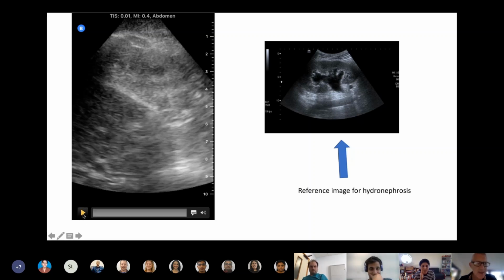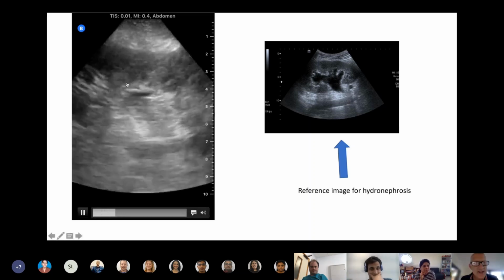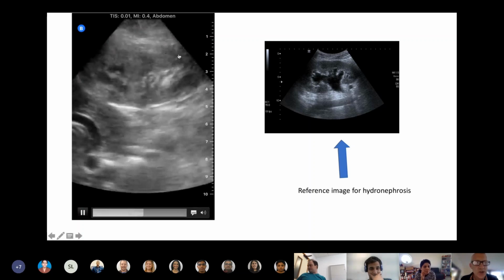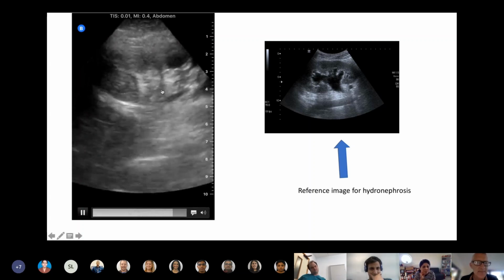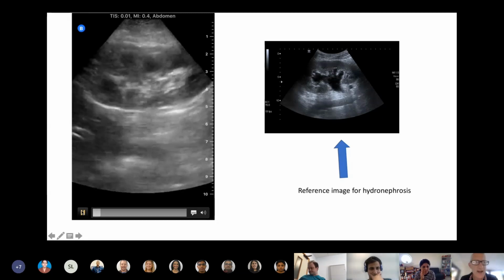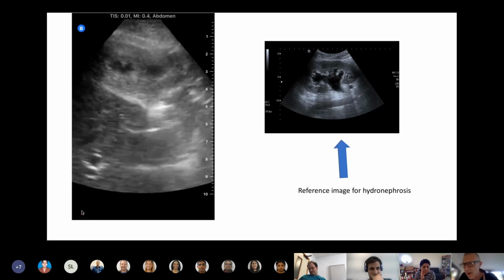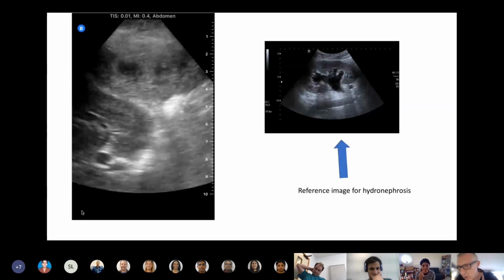So this is me scanning in the longitudinal plane, again with her just sitting forward in her high back chair in her room. And here we have the renal pelvis, so it's white in the middle, it's not being pushed back. So this is actually a normal kidney in longitudinal view, and that's a liver there. This is a right kidney. The left one looks the same as well. So we're pretty happy, I'll just show it again, as we fan through the kidney, that this isn't a surgical cause. I mean, you could argue that if you're 94 with all those comorbidities, if you found it, what would you do? Well, we could prognosticate and we could talk more with family.